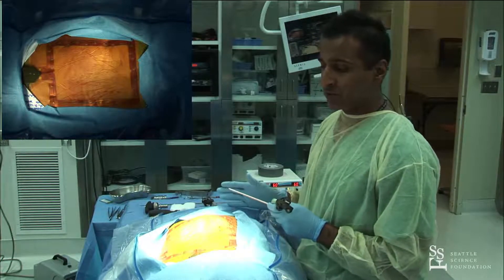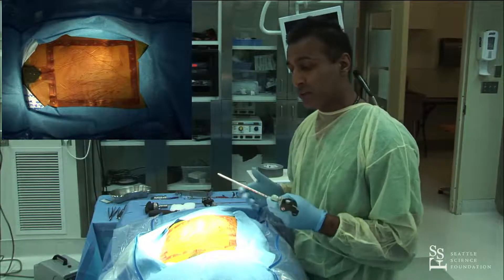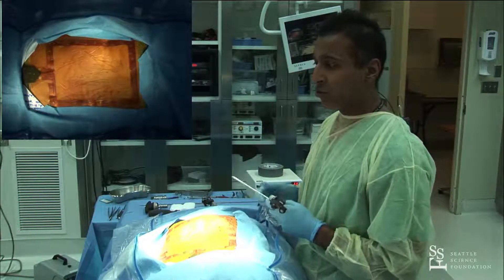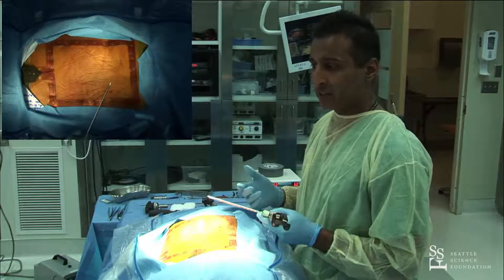I'll use the mask in an unindicated fashion in other areas of the spine to capture more. It's really more a function not of what the mask can capture, but of what your CT scan can capture.